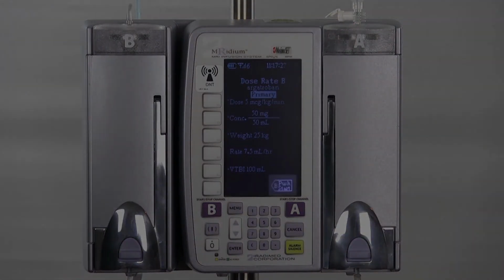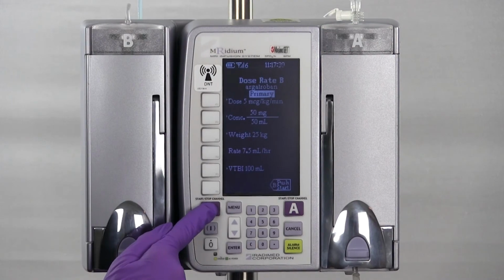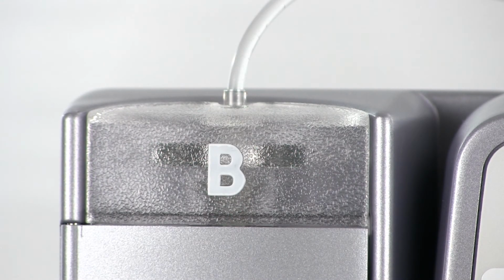Push Start B will appear on screen in the bottom right corner, and the user will start the infusion by pressing the B Start button. The status light will flash green, which indicates the pump is infusing. The dual infusion is now in progress.